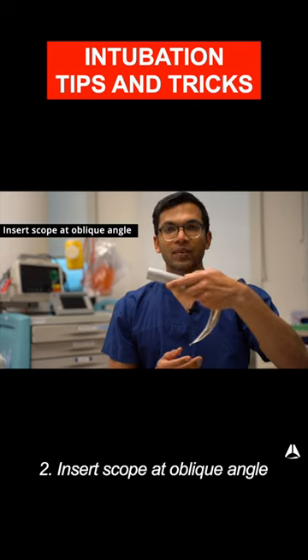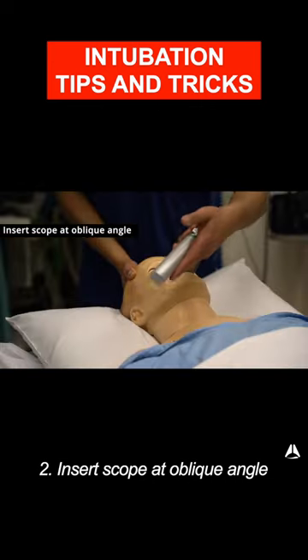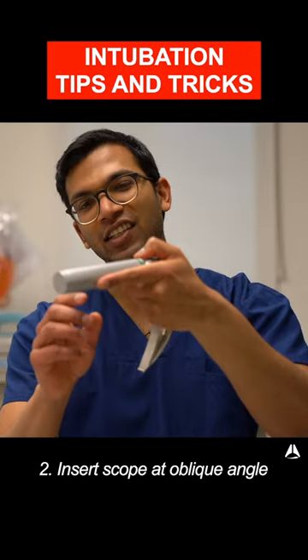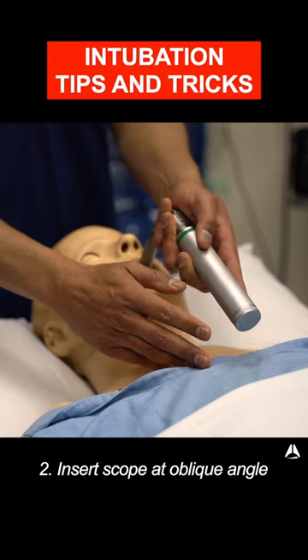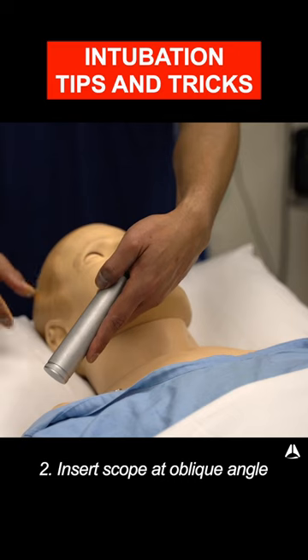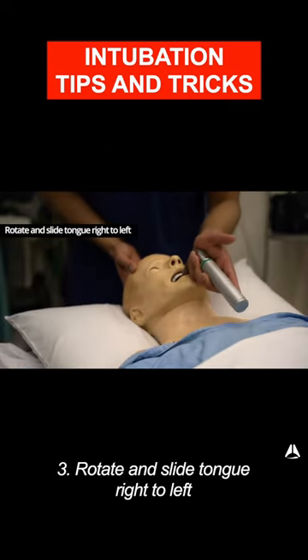I then insert the laryngoscope. Most people tell you to insert it like this, but what I do is insert it slightly to the side. In some people, this handle might get in the way, or the chest might get in the way of the handle. If I insert it to the side, that's never a problem because there's always space. And once it's in, I then tilt it around.